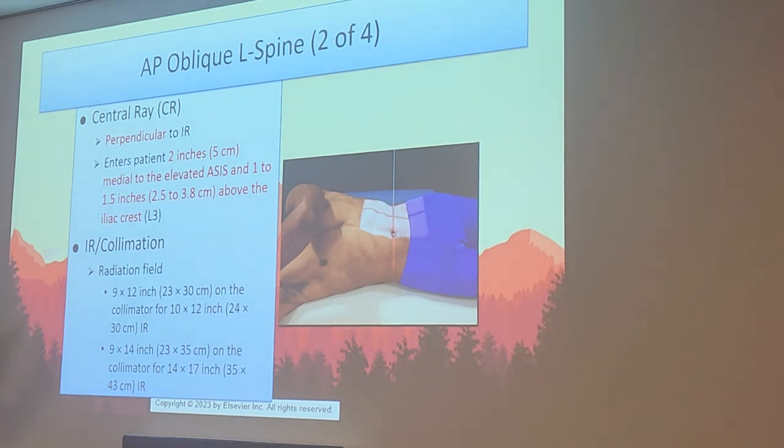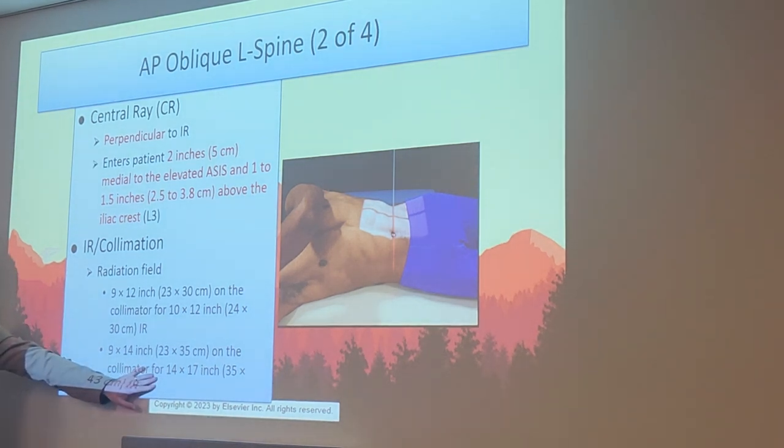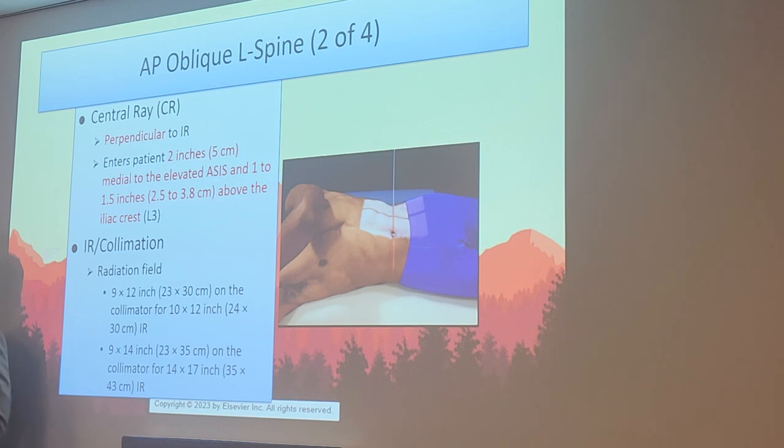Why would you ever use a 10x12? I don't know, but it is an option. Me personally, stick with your 14x17. It's a lot of area to cover. You want to make sure you have the entirety of L1 through L5. 14x17 needs to be collimated down to a 9x14 to only include that L spine, with all that extra tissue in there. So you want to be able to see those zygapophyseals really clearly.